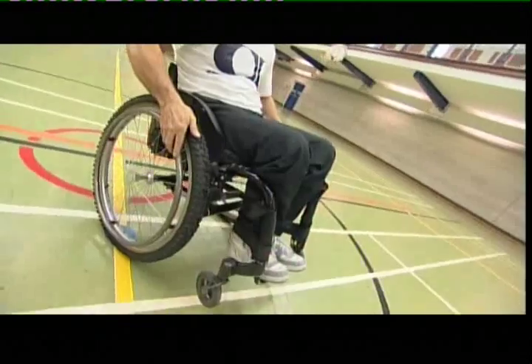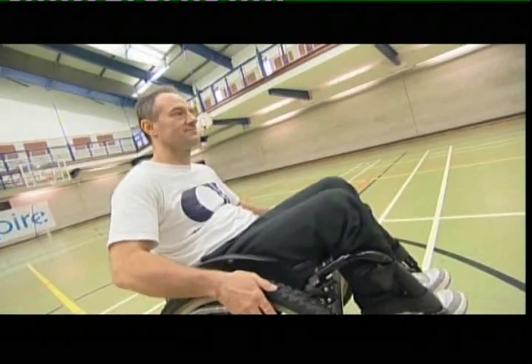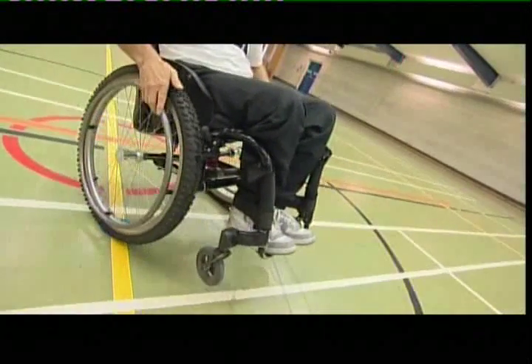Unfortunately, the excitement of that particular day was brought to a crashing halt by the arrival of a man called Robin Gibbons. He wanted to test our wheelchair, and he got in it and he flew across the gym at very high speed. And as soon as he did it, it became obvious we had a wheelchair that wouldn't go in a straight line. This thing was like driving a tea trolley around. It was a complete and utter disaster.